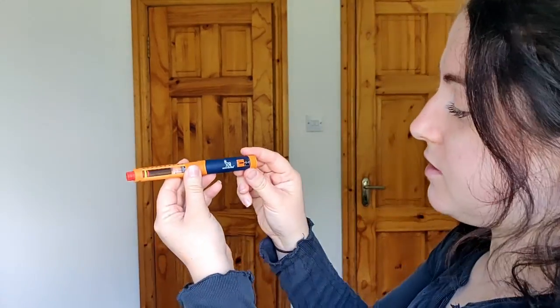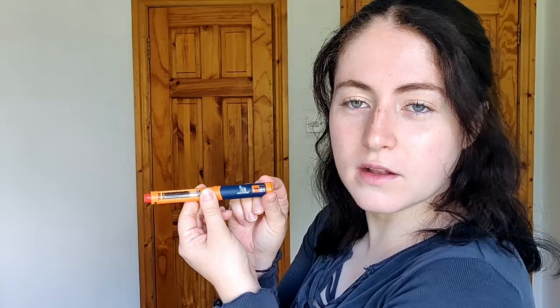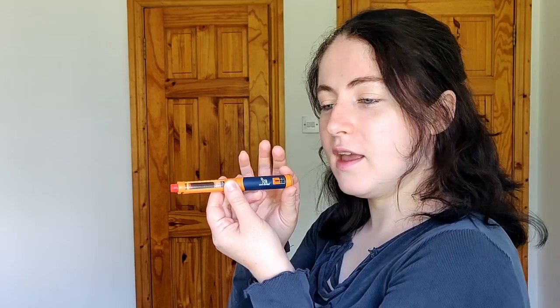The great thing about this one is it actually did do half doses. You can actually hear the clicks for the first time as well — that's a new feature. Before this, insulin pens didn't have that click, which is very useful because a lot of diabetics can have vision impairment. So if they can't actually see it, how would they know how to dial up their insulin pen? Being able to hear the clicks when dialing up is a major advancement to know you're getting the right amount.